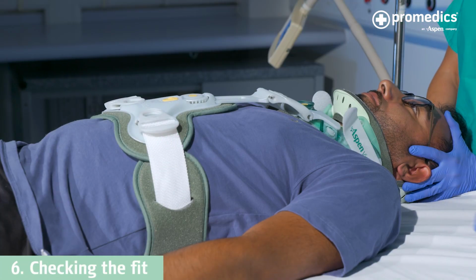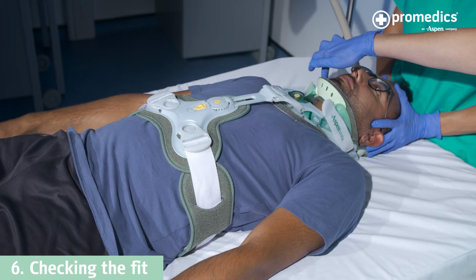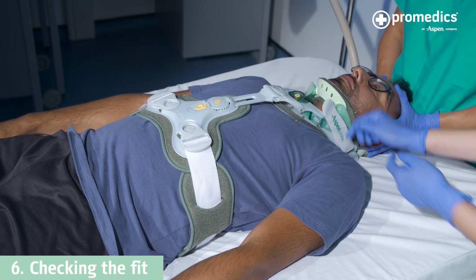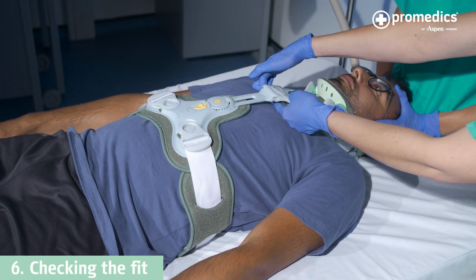Check both Velcro straps are aligned symmetrically. The collar should be flush with the skin and there should be no gaps in the collar. To check this, push your finger down past the ear, behind the mandible, and run your finger along the collar towards the chin and then underneath the sternal aspect of the collar.